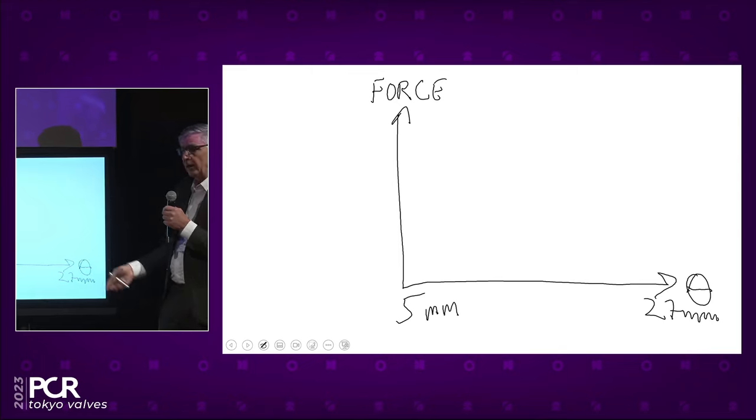We know, I don't know whether you know about the Chinese valve, the Venus-A, it has a very strong radial force. But we don't really need that sort of radial force to safeguard a very satisfactory EOA, even if it is very calcified. Because I think there's some confusion about what people mean when they talk about force. Maybe we can have the smart screen up so we can see it.